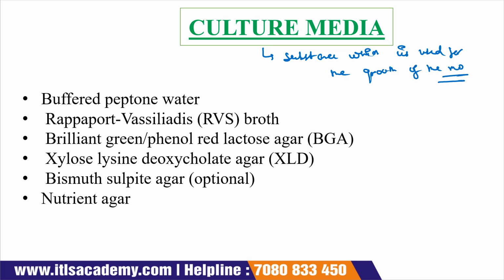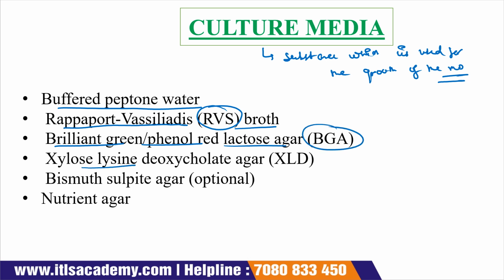Here the culture media that we are going to use are buffered peptone water, Rappaport Vassiliadis broth, also called RVS broth, brilliant green phenol red lactose agar BGA, xylose lysine deoxycholate agar XLD, and bismuth sulfite agar, which is optional, and nutrient agar. Now see the composition of different culture media.